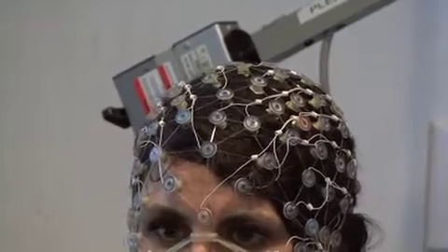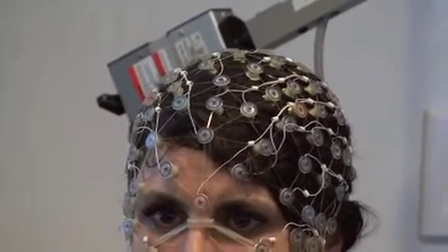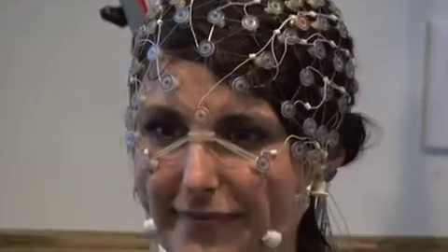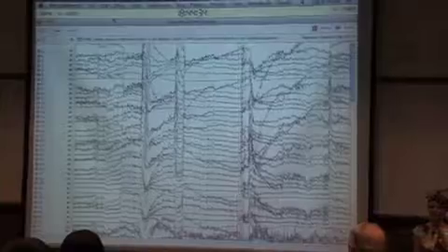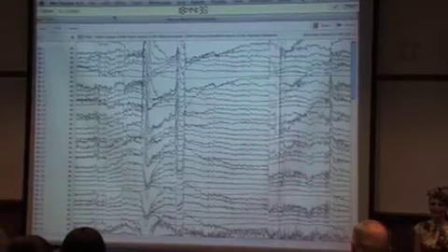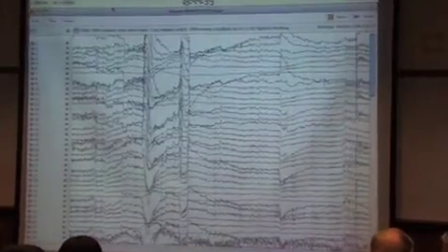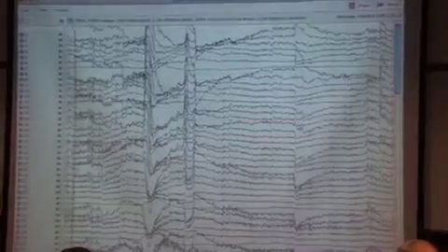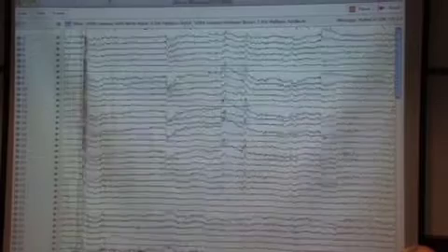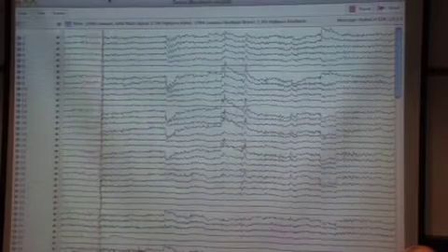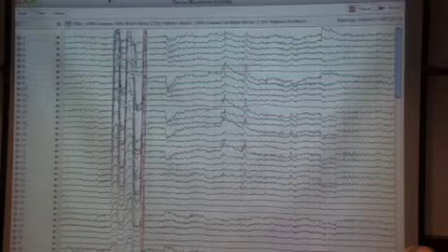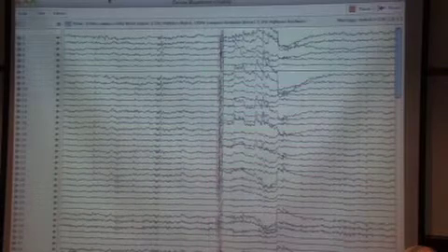First we place some electrodes on the head. Then we have a computer that can present stimuli to our participant. What you can see here, each of these wiggly lines is one of these electrodes that's on the scalp of our participant. Heather, can you blink three times, please? Nod your head for us, please.